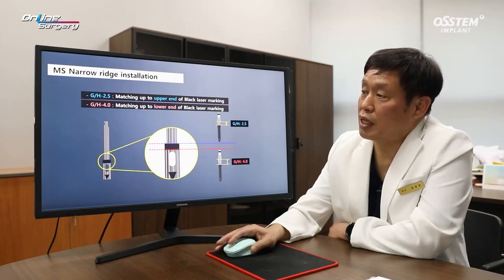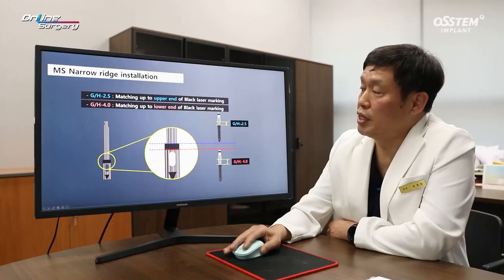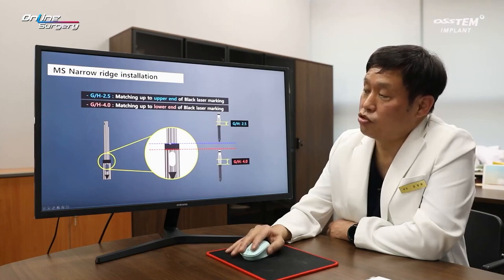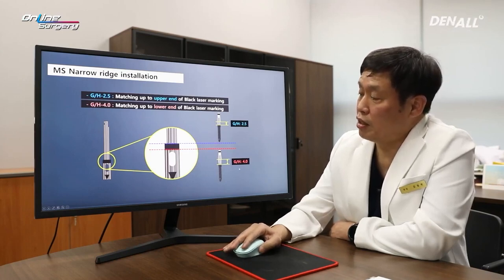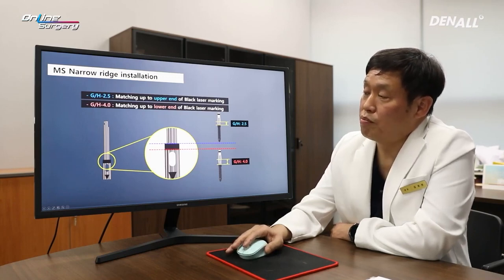As for one MS, if you look at the implant driver, there is a black laser marking. As for MS implant, there are two types for gingival height: 2.5 and 4.0 mm. In the case of 2.5 mm gingival height, you can do full length drilling up to the laser marking — the top part of the laser marking. And if the gingival height is 4.0 mm, you can drill up to the lower part of the laser marking to position the implant.